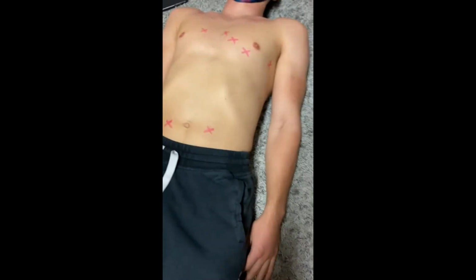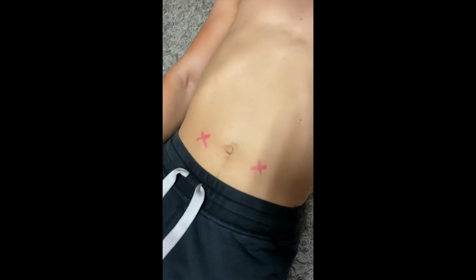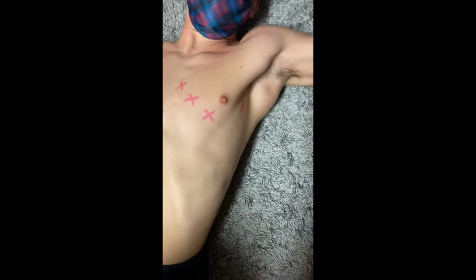All right, and then now finally for V6, I'm sorry. Josh, can you please put your arm out to the side? To the side as best as you can. I know that's in the bed there.